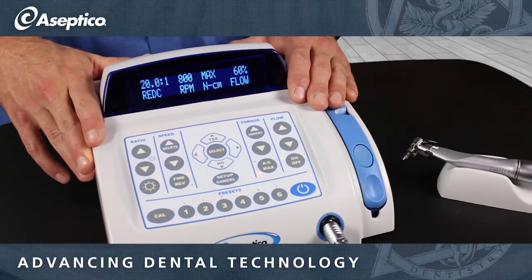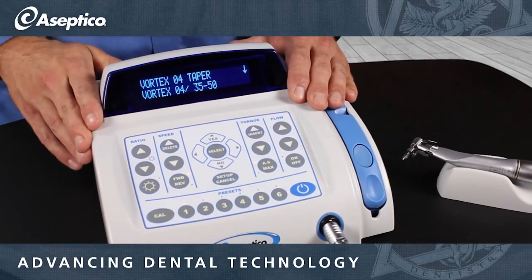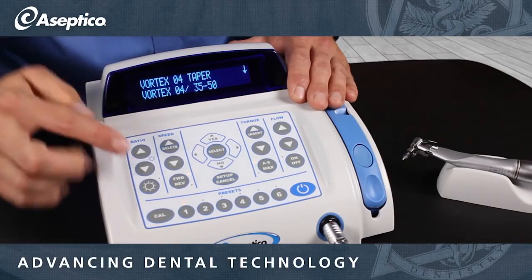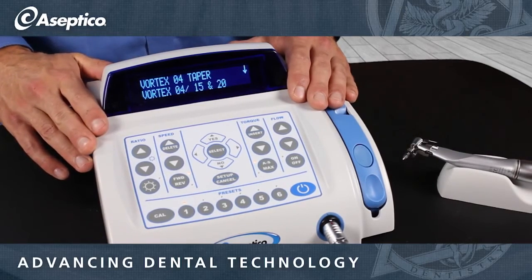Now, with your endo mode — which is as easy as switching using the select button — your presets are going to have all the Tulsa files pre-labeled on them. You don't have to use Tulsa files with this; it just makes it easier. You'll notice that it's going to start out with a certain file, and if you press that button again, it's going to cycle through that vortex series or whatever series is selected on that preset.